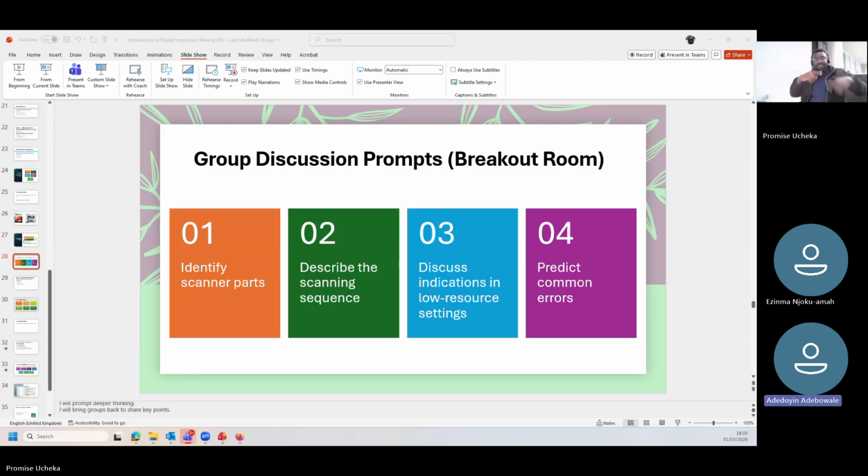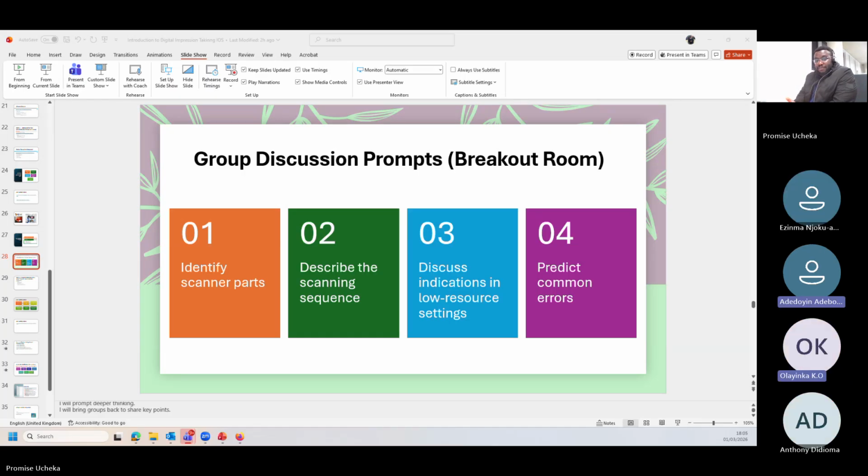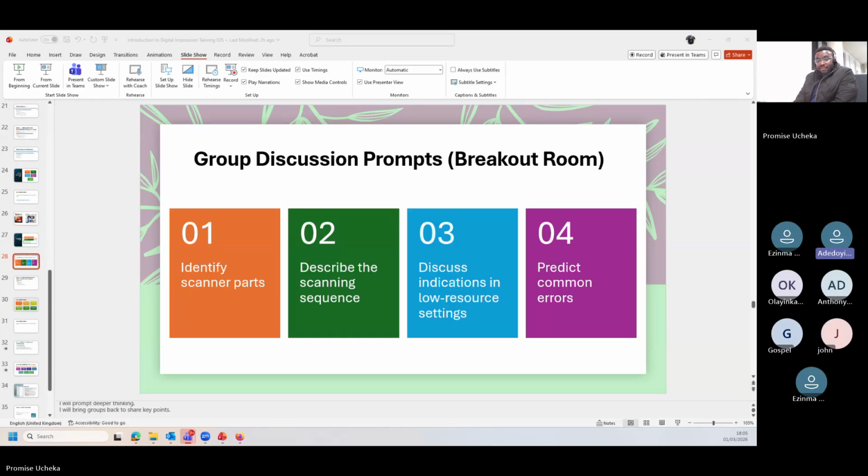because when I worked with a dental scanner, it comes with a milling machine, and where I worked with it, we have the milling machine right there in the clinic. So you just send it, we take our computer aided design down to where the milling machine is, and if you want to select the crown or anything, that's the way it kind of works, right? So that was why I was talking about the indication. I wasn't comparing and contrasting. That was not what I was saying. I don't know if you got what I was trying to say.